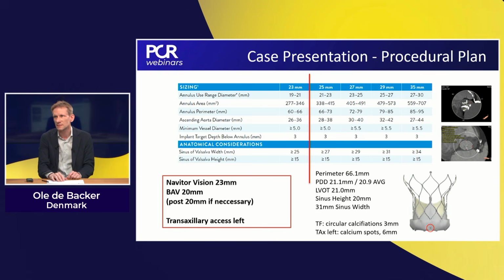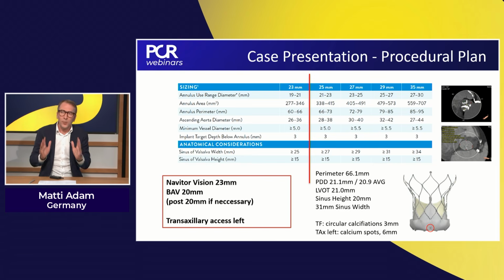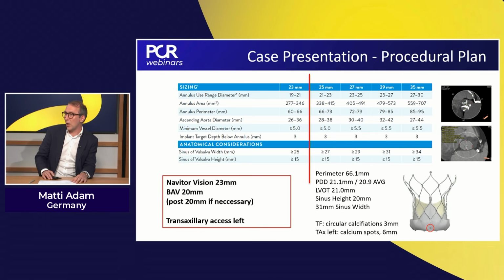I like what you said, both. I agree, and that's exactly why we decided to use the Navitor 23, because no pinwheeling, good stent frame expansion. So that's actually exactly our thoughts. So let's see how that went, right?